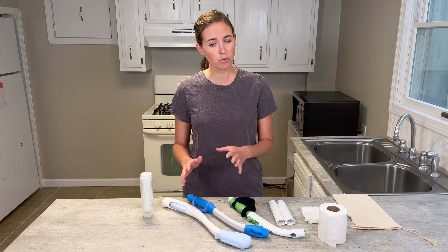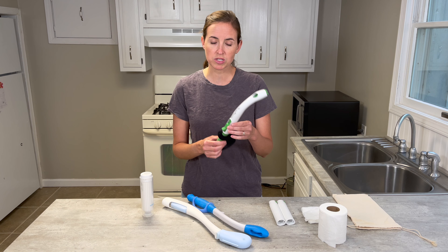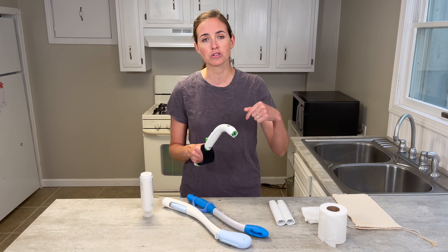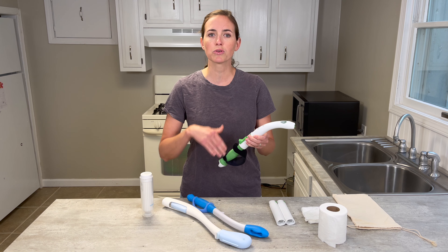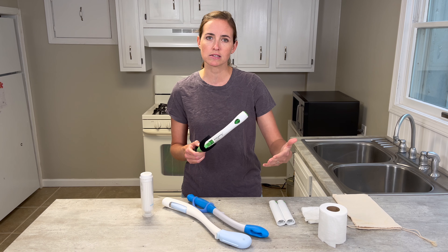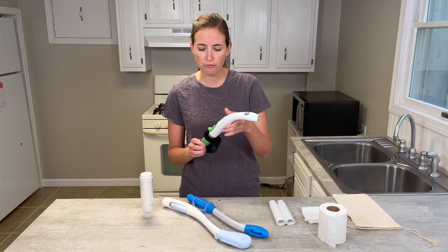I'm going to start with one of my favorites, the Freedom Wand. The Freedom Wand was designed by an occupational therapist — Deb is fantastic, really good customer service, so I'll make sure there are links down below. The Freedom Wand was designed to be a really multifunctional wiping aid. It can also hold things like a razor, a loofah, or a lotion applicator, so it's a pretty versatile tool.